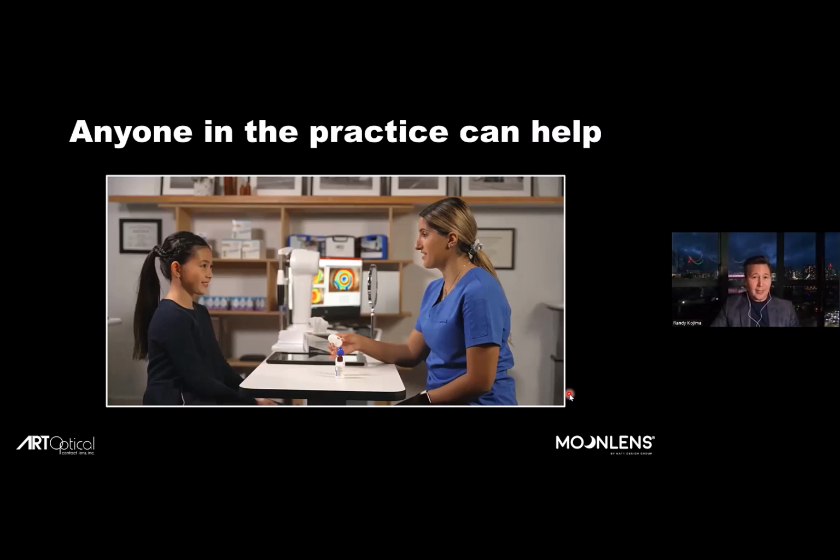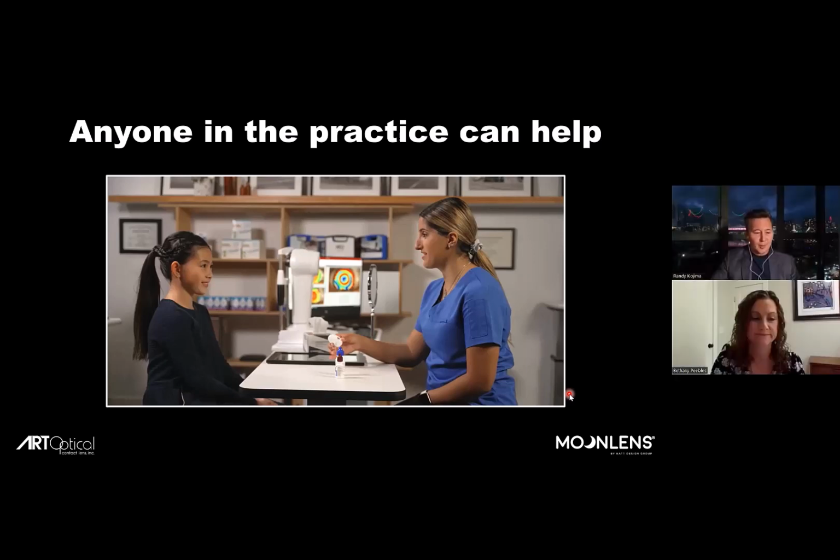Bethany, could I ask you a little bit about both the MOONLENS and the KATTCloud in general? I'm making claims that it makes practice efficient and easy. You've worked with many ortho-K lenses over your career. How does this KATTCloud fit into modern practice? Is this a tool that does in fact make practice efficient, accurate? I mean, could you give us some of your perspective from the consultant desk?